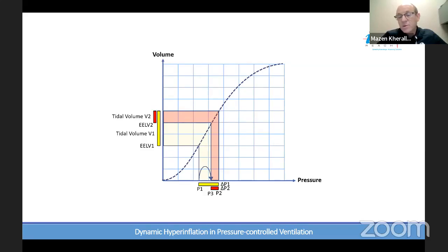Okay, so the first thing you do if your patient is hemodynamically unstable, blood pressure 70, since the principle is to provide a longer expiration for the patient, the easiest way is to disconnect from the ventilator. Once you disconnect from the ventilator, the patient will exhale everything in his chest and you eliminate it. Now, when you put the machine back on, you need to adjust it in a way you can provide longer expiratory time for the patient, so this does not happen again.